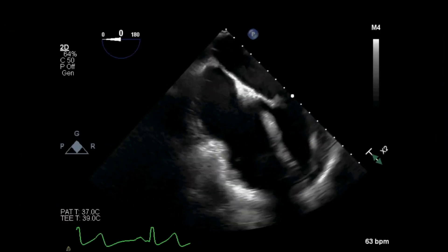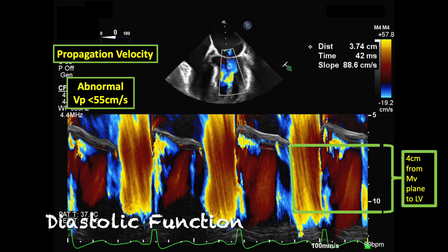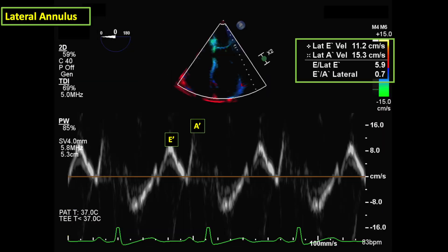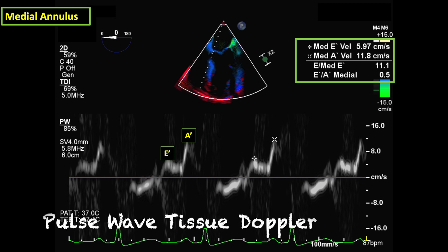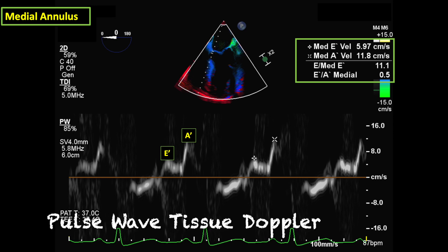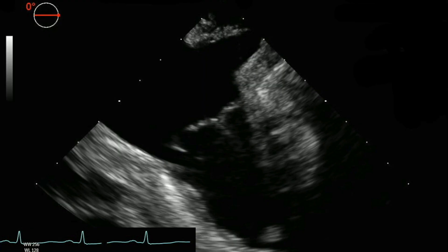I assess the left ventricle's propagation velocity with M-mode and the mitral valve's lateral and medial annular velocities with pulse wave tissue Doppler to supplement my overall assessment of diastolic function.